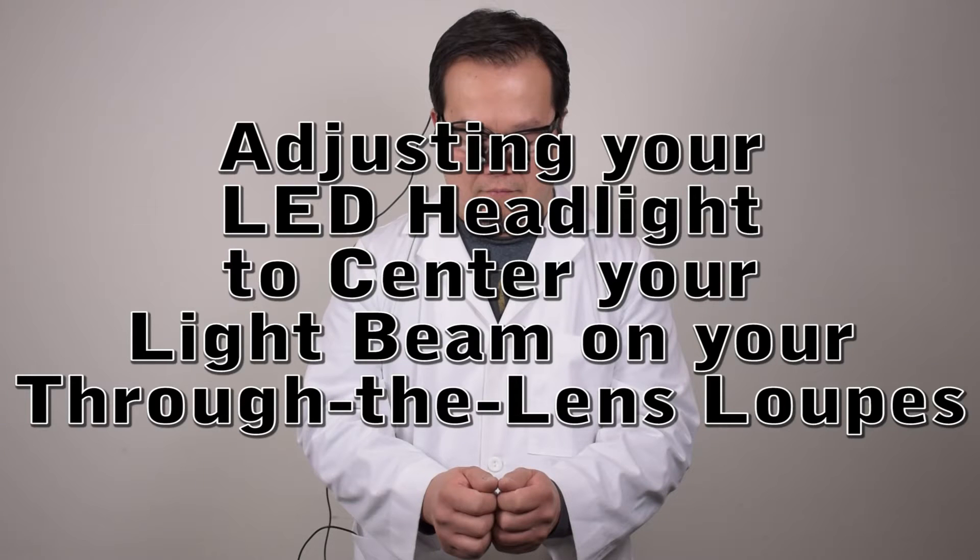Adjusting your LED headlight to center your light beam on your through-the-lens loupes. If the beam of your LED headlight is not aligned with your target, there are several ways to adjust your headlight.